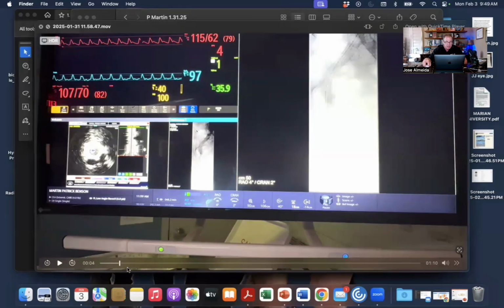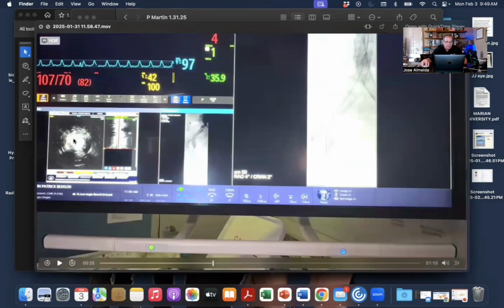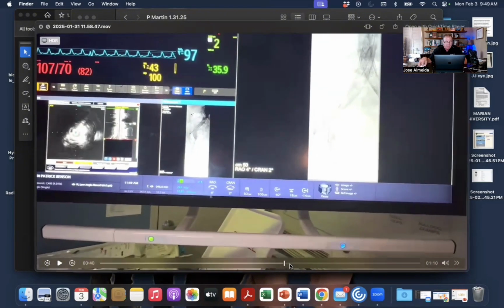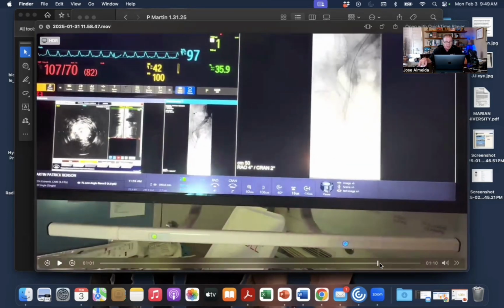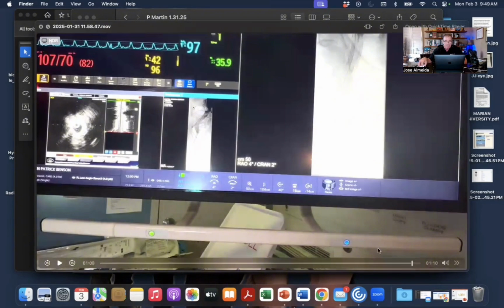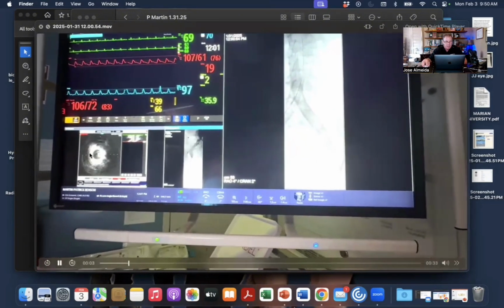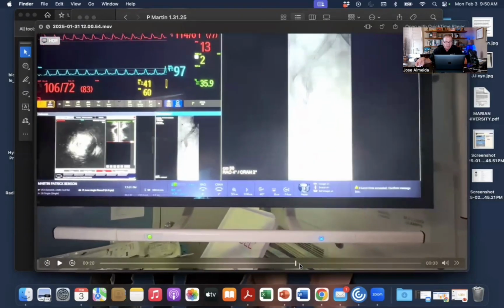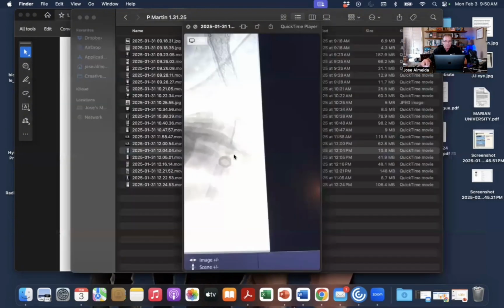Just look at this area. You'll see multiple other areas of narrowing, like here. And as we go up and down, you see the IVUS catheter going up and down the right side. You see how narrow the stent is from being relined, but it's open there, very tight here. All right, and in this area, we did a balloon angioplasty and then completion IVUS. Things are looking better and more open. So that looks a lot better after balloon angioplasty on the right, and contrast venography showed pretty good flow.